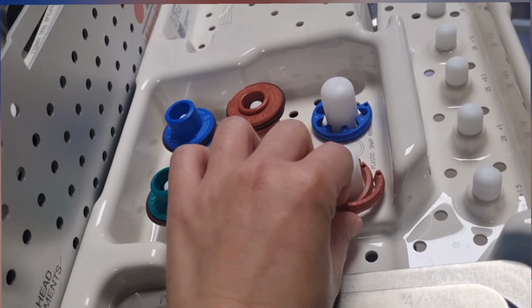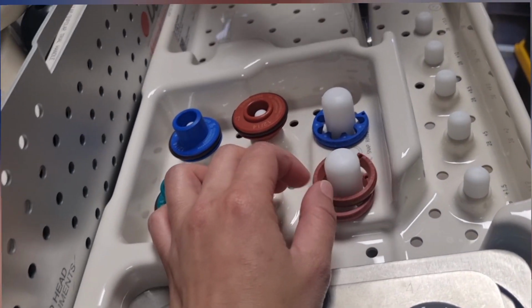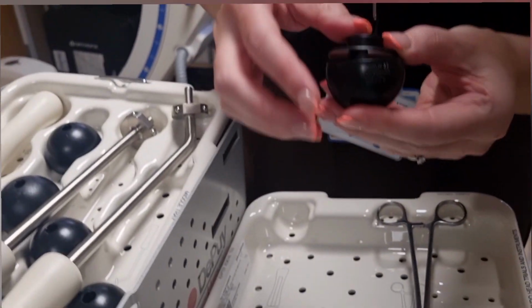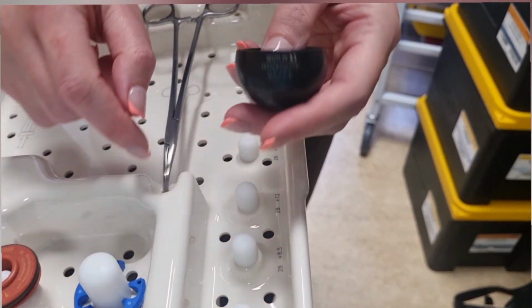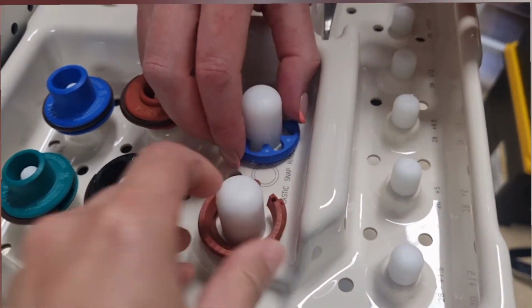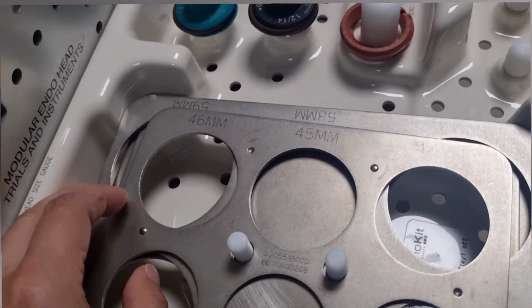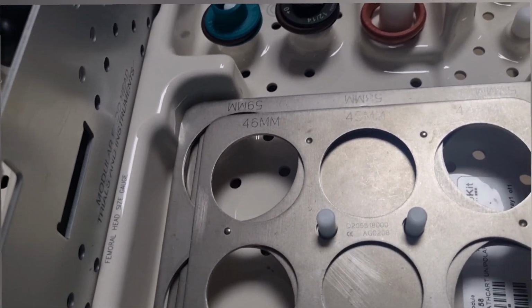What is this for? This one I've never used before. Yeah, it's a very good question. Plastic snap rings, because these just go in. This is a 0. There's only 4 sizes. I actually don't know. I've never used it either. I'll have a look. They're just a sizer, a template size. Because obviously you'll cut the head off, and then they'll just use that as a template.